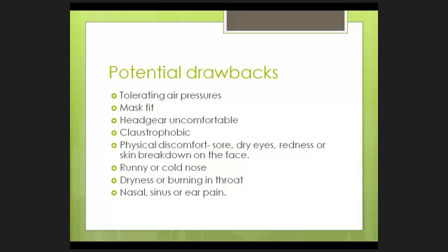Other potential drawbacks for CPAP masks in general include being able to tolerate CPAP pressures, the mask fit, and uncomfortable or ill-fitting headgear. As mentioned before, claustrophobia can hinder the use of CPAP and wearing a mask. A variety of skin discomfort can occur, such as sore, dry eyes, redness, or skin breakdown of the face, a runny or cold nose. Usually the use of a heated humidification can help this, as well as dryness or burning in the throat. And nasal sinus or ear pain can also occur with CPAP use.